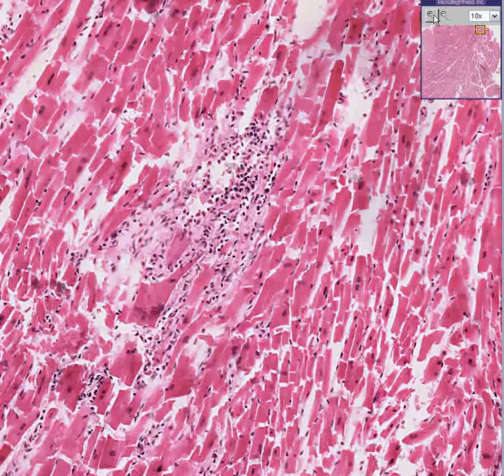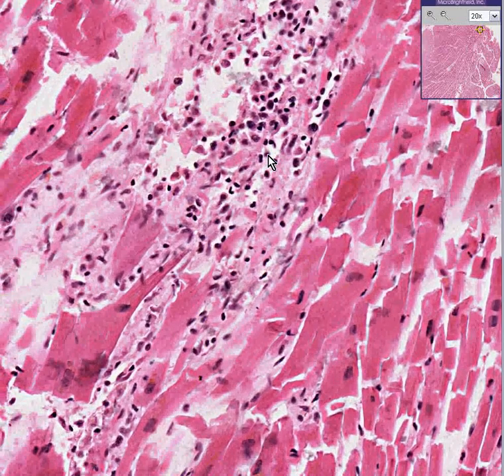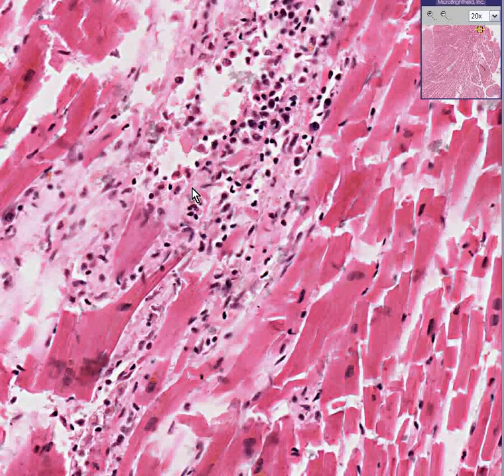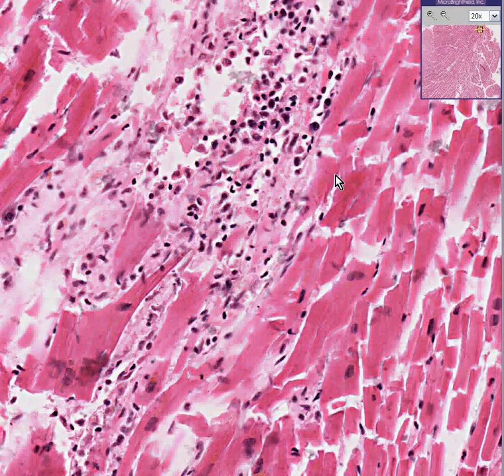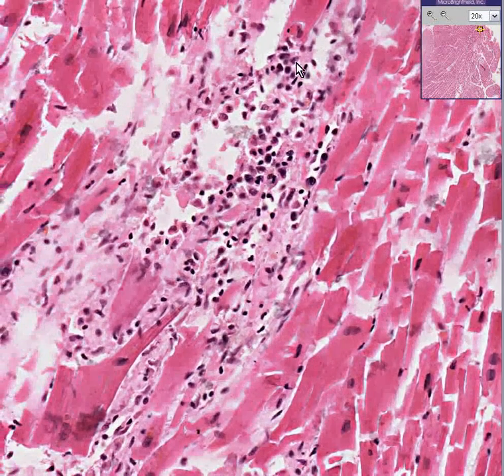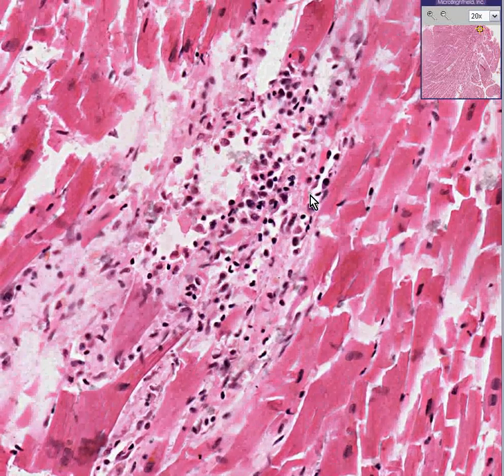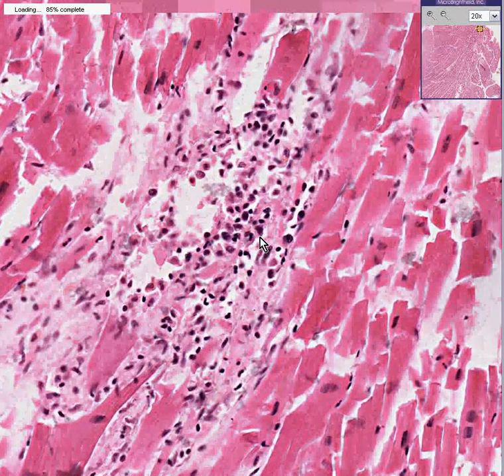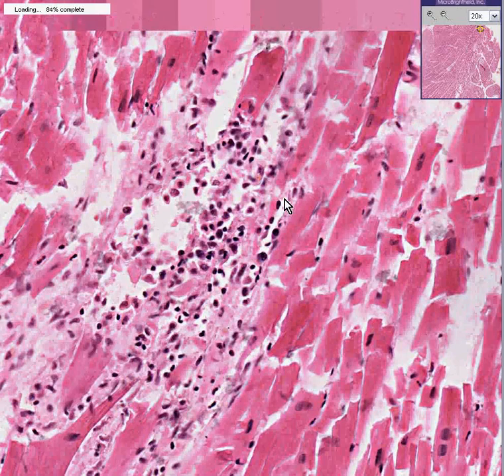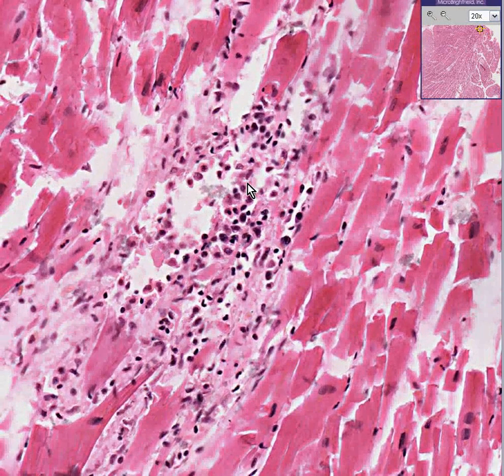This is an area of inflammation. It doesn't look like the kind of inflammation you would get in an infarct, because there's no real necrosis of the fibers, and it's more of a little pinpoint microscopic focus rather than a zonal thing, like you might expect with an infarct. This is a myocarditis — this is an area of myocarditis.